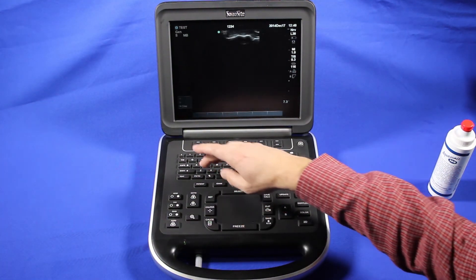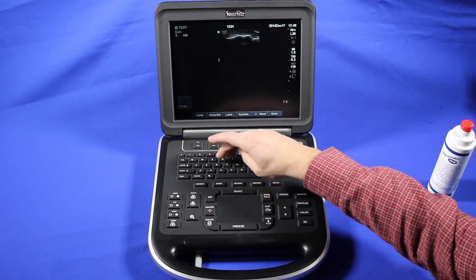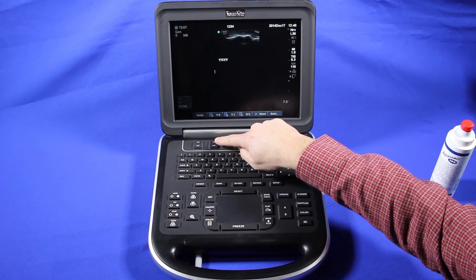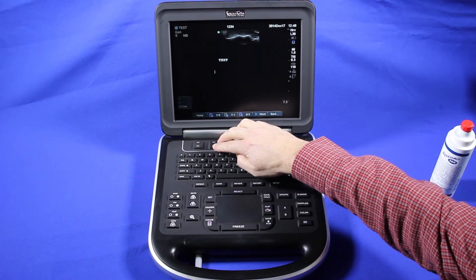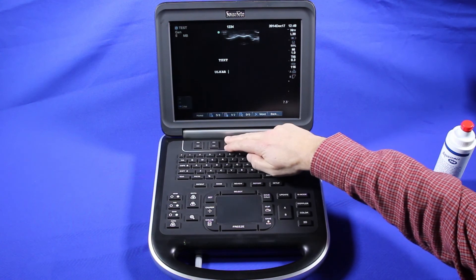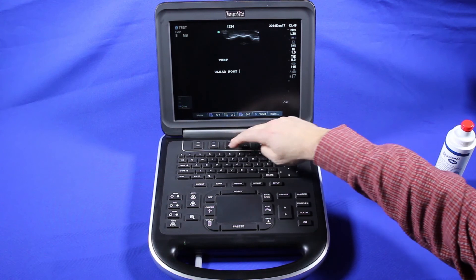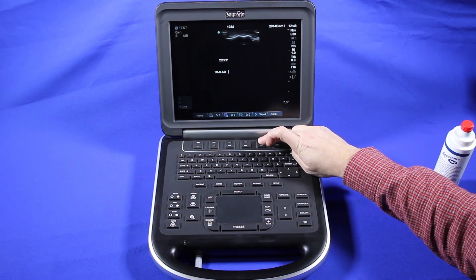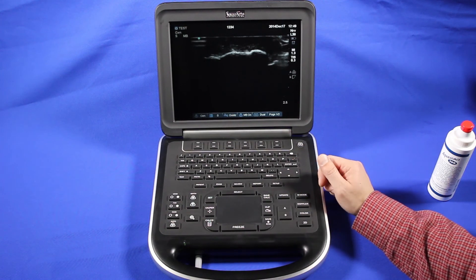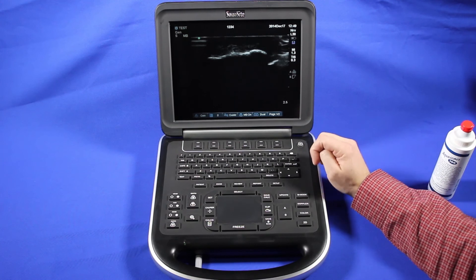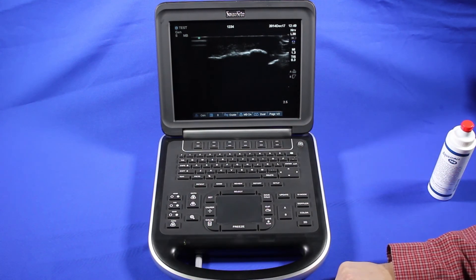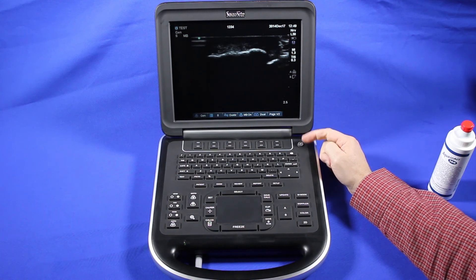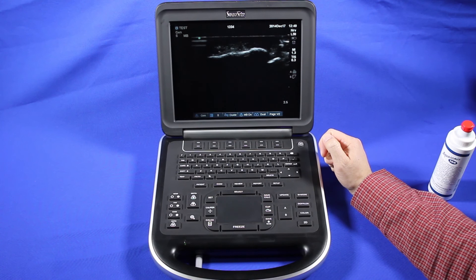To annotate an image, you'll hit freeze, then hit text. You can scroll this to wherever you'd like and type manually. You can also choose a label, which will bring you to annotation libraries that you can preset — covered in the setup video later in this series. There are 8 different choices in this library. I want to take a note here: when you push controls up top, watch where you rest your hand. Twice in a row I've accidentally touched the power button, which shuts down the entire machine. So when selecting anything up there, be careful — I've done it twice with this machine.